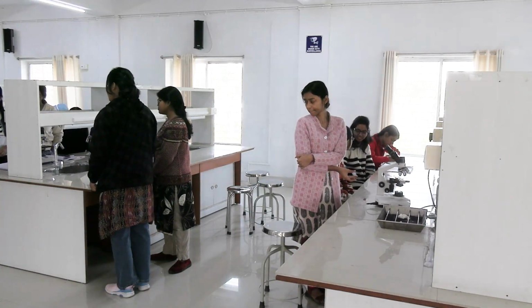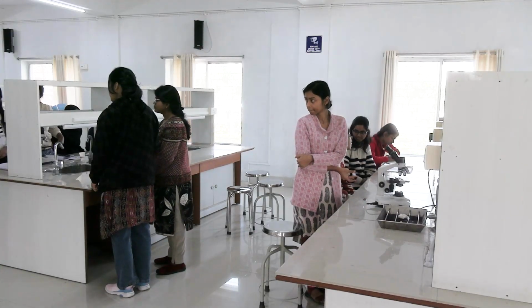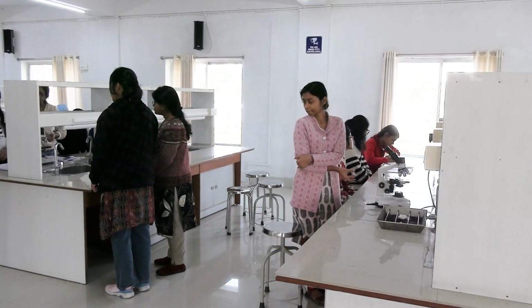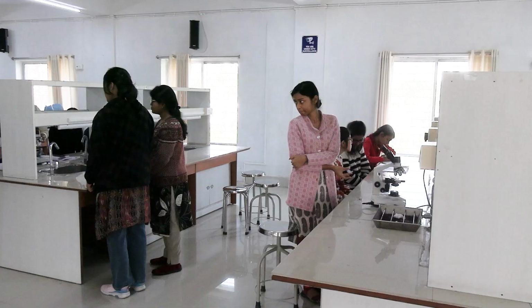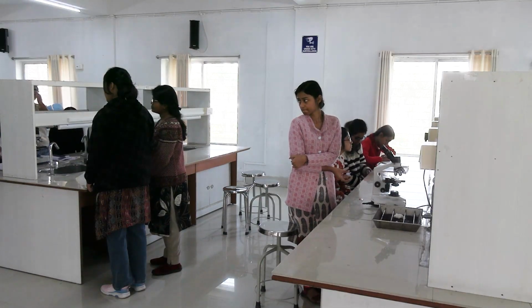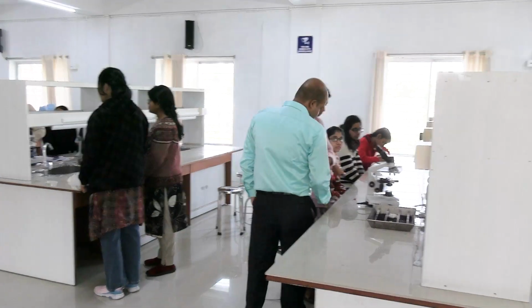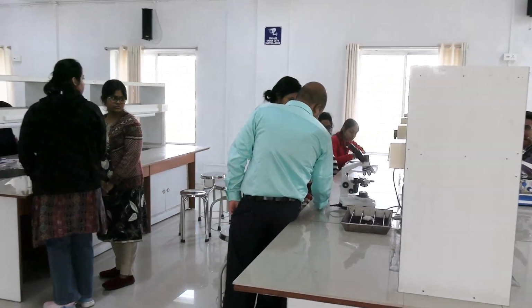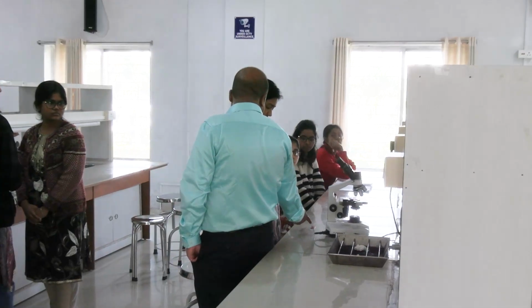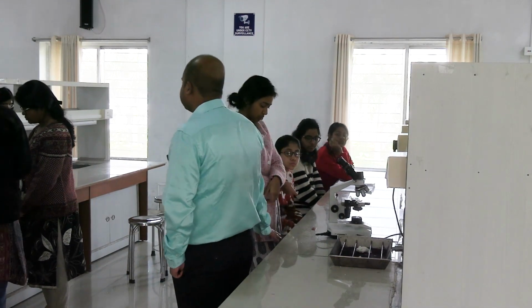Usually the question given in the exam is to determine your own blood group. So you have to prick your finger, and the experiment procedure is whatever you did now. You prick your finger and just mix the antisera and the blood and see the agglutination reaction. So did you notice what this is? A and A blood group, A, and is agglutination occurred or not? Occurred. So it is A positive, A negative.